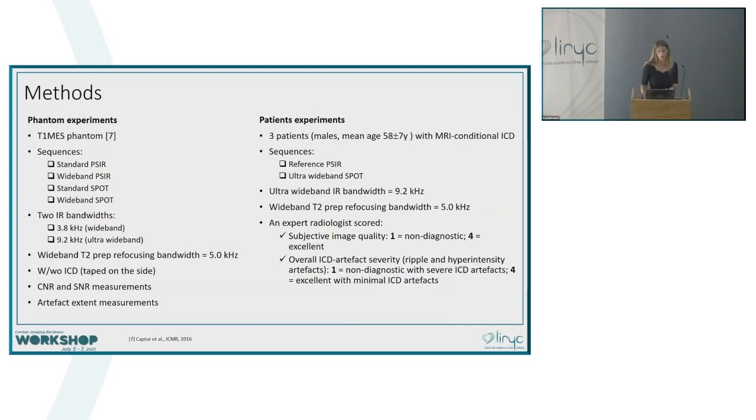For these patients, we applied the reference here, so without wideband, and then we applied our technique spot with ultra wideband, so where the inversion pulse has a bandwidth of 9.2 kilohertz and the T2 prep refocusing pulse bandwidth of 5 kilohertz. An expert radiologist scored the image quality, 1 being non-diagnostic and 4 being excellent, and also she assessed the overall ICD artifacts.